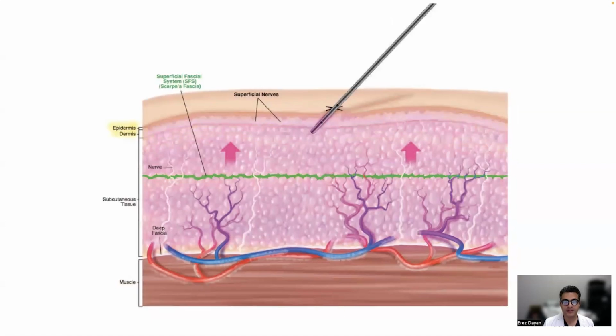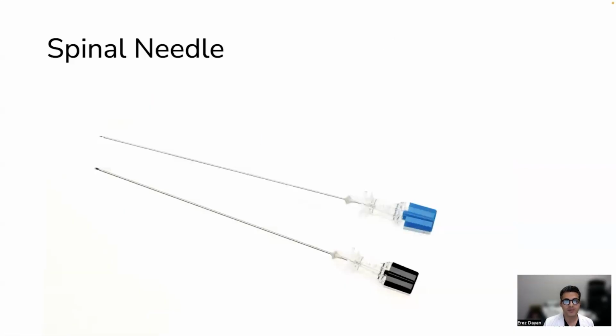At the end of all this, you can test the efficacy of the local anesthetic by passing the tumescent cannula in the subcutaneous tissue under the skin to ensure that the patient's numb completely. Some people like to use a spinal needle, which is smaller than a tumescent cannula, to inject the tumescent. I think that's totally fine and works well and may even be a little more comfortable.